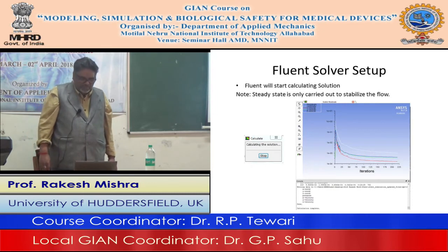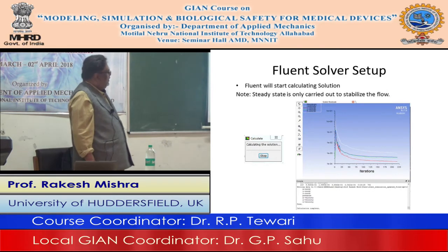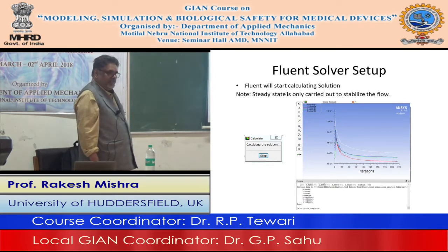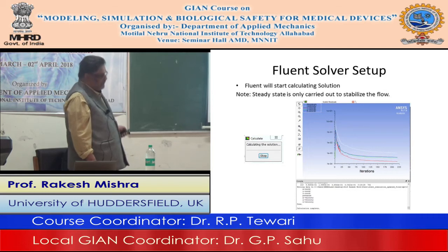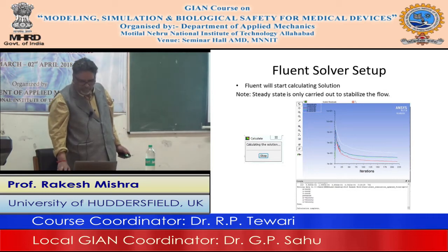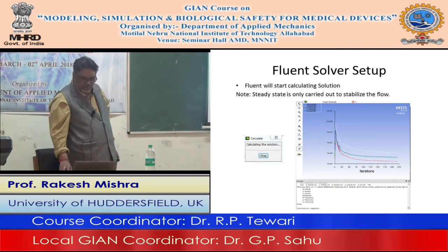Okay, so next thing is, how do we create a UDF for the pressure signal at the inlet? So what we do is, we go to general here, and press transient. So that is the first thing that we have to do to run it.